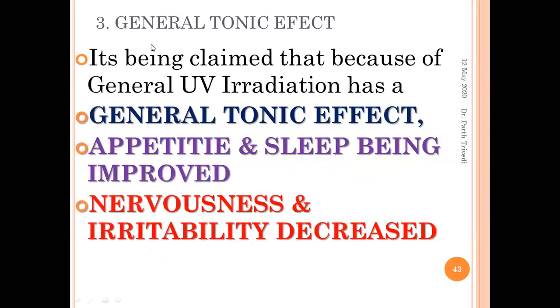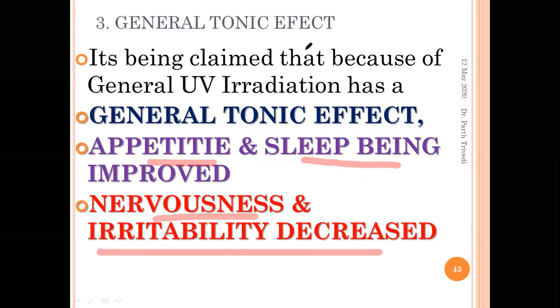General tonic effect is the third one, which is the general effect. It is claimed that because of general UVR, it increases appetite, sleep is improved, and it decreases nervousness and irritability.